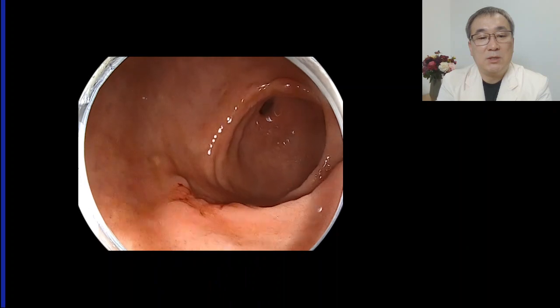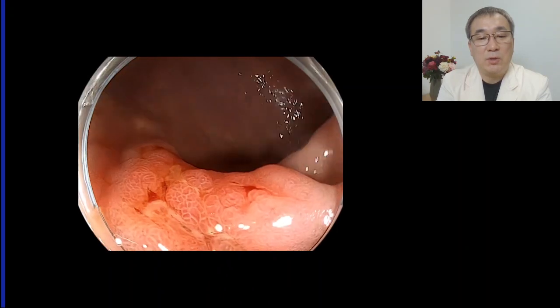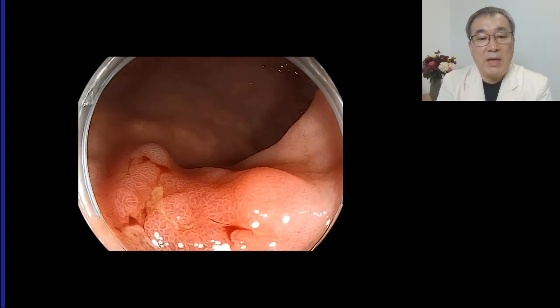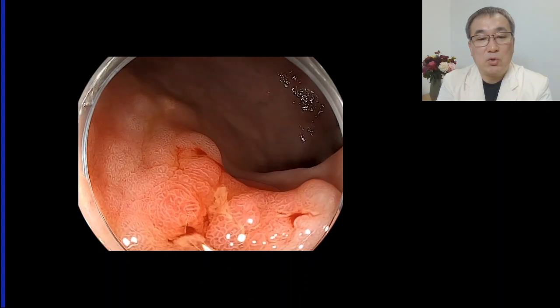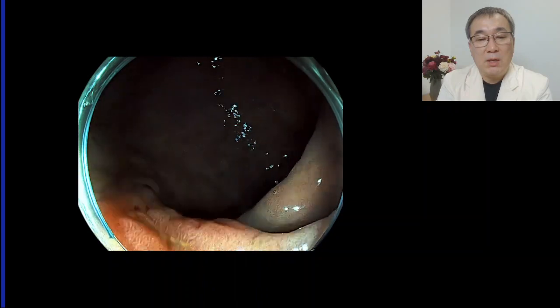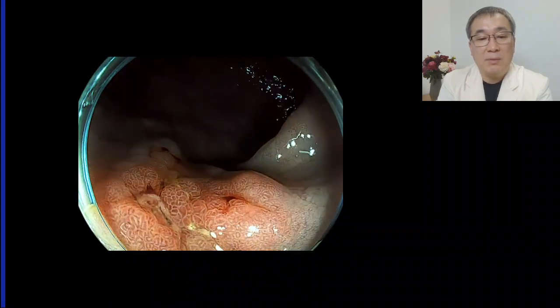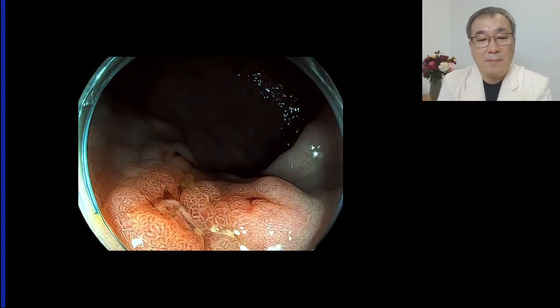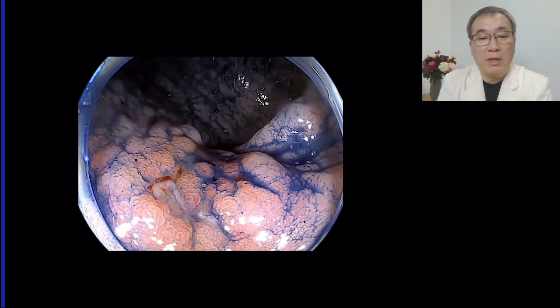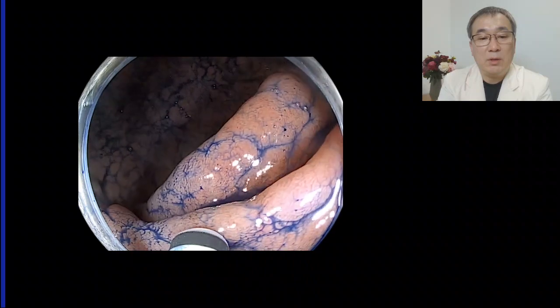Anterior aspect of the antrum, there is a depressed lesion. Pentax I10C gastroscope close-up image is so good. This is image-enhanced endoscopy named iScan. I usually use indigo carmine to determine the lateral margin of the tumor.